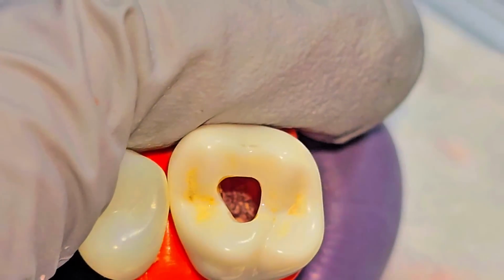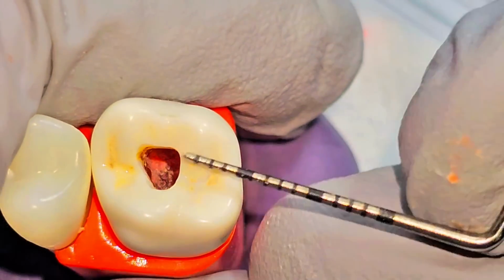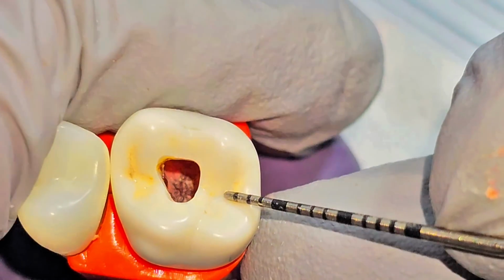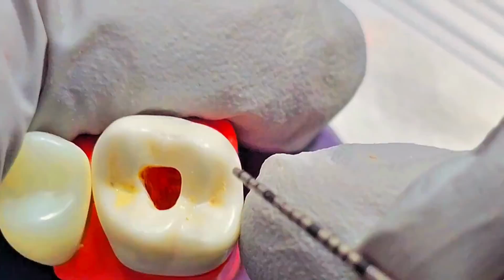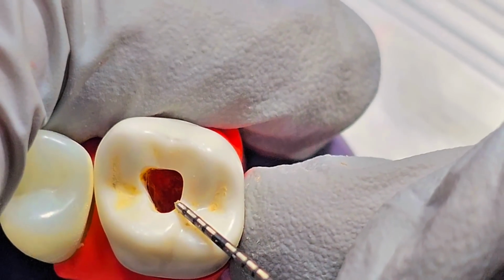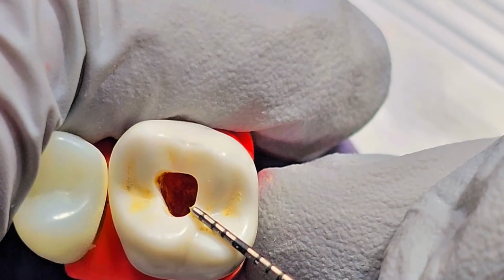Okay, so final check with the explorer, the probe. This is the groove, and we have almost 3 millimeter away from the groove.